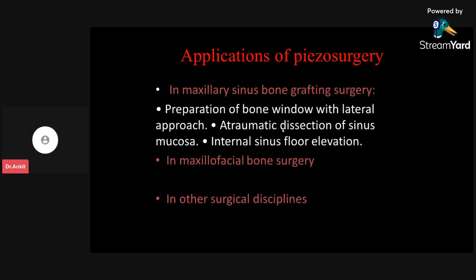Okay, application of piezo surgery in maxillary sinus bone grafting surgery. We'll be seeing this in the third presentation of our lecture, that is the preparation of the bone window with lateral approach, and atraumatic dissection of the sinus mucosa. We have beautiful seven to eight cases done and performed with proper documentation, which we can see, and I have performed numerous cases using the piezotome. And there is internal sinus floor elevation, also known as indirect sinus lift.